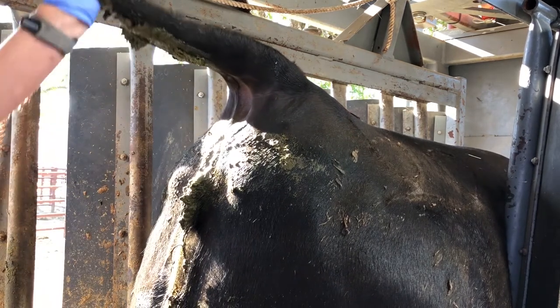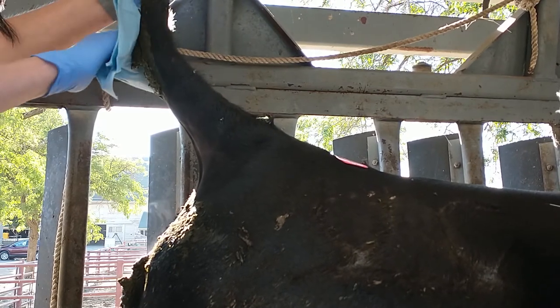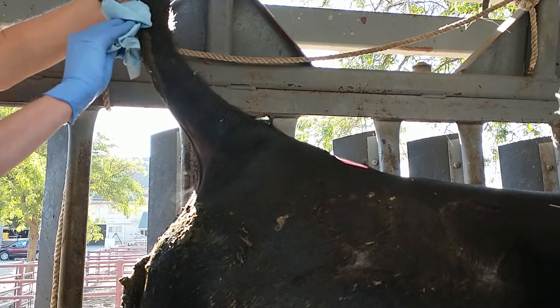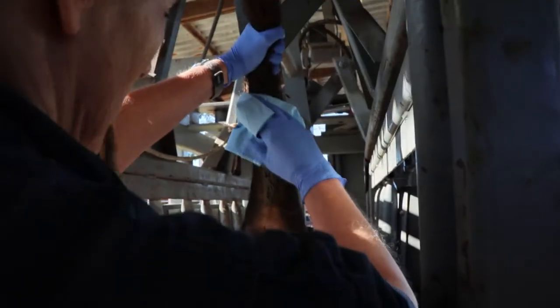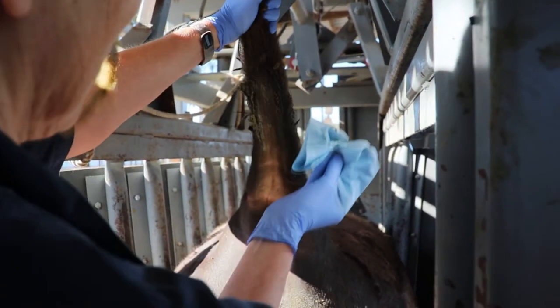Make sure you have adequate restraint for a beef cow. That typically means a cattle chute. Position yourself behind the cow and lift the tail. This requires more force than you would expect. They do have pretty strong tails. If there's manure, you want to clean the underside of the tail with a paper towel.